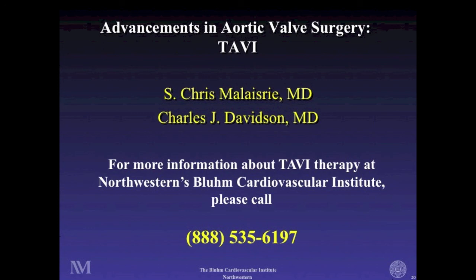That's a great finishing question, quite honestly. What we've seen in the early going is using this in high risk and inoperable patients. The trial that we're doing now, the PARTNER 2 trial, is trying to bring this into that intermediate risk group that Chris described, the people with operative risks somewhere between 4 and 10%. The next step will be to see whether this could be brought into the low-risk group.